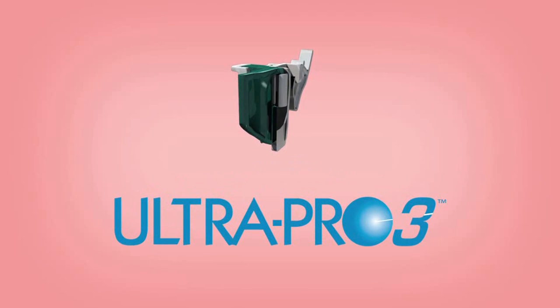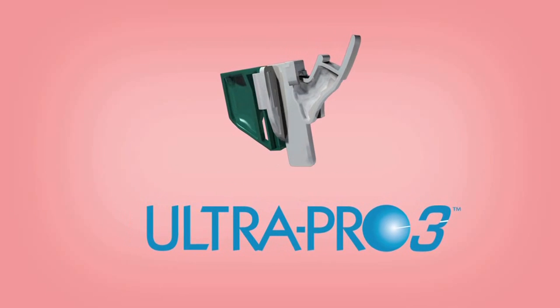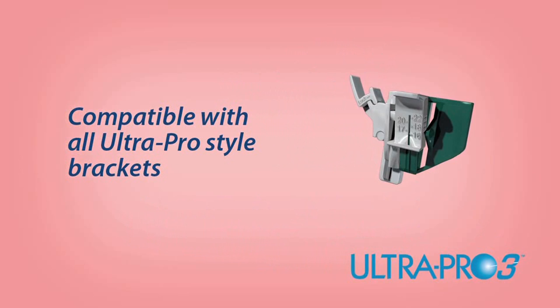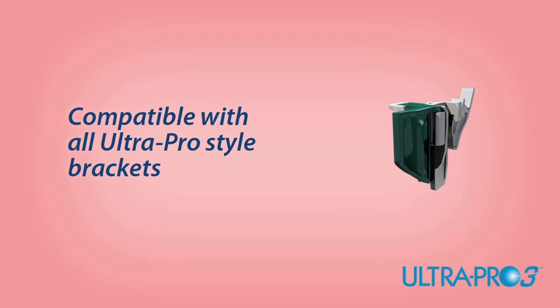The UltraPro 3 is a unique needle guide designed specifically for clinicians who like the benefits of guidance as well as the tactile feeling of free handing. The UltraPro 3 needle guide is compatible with all UltraPro style brackets created custom for leading ultrasound equipment manufacturers.